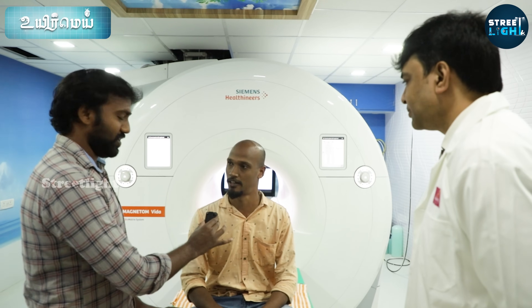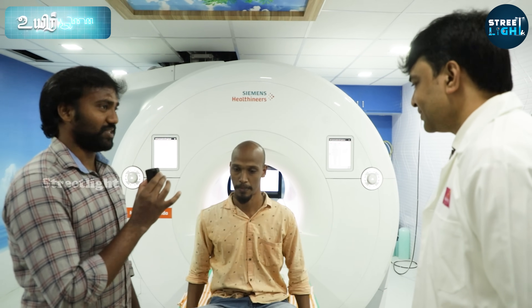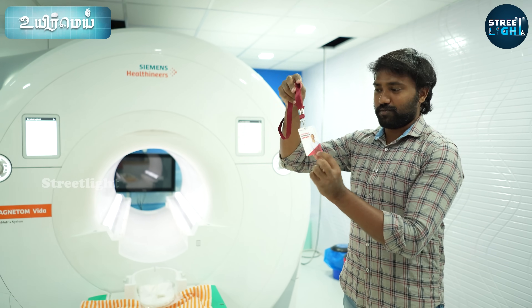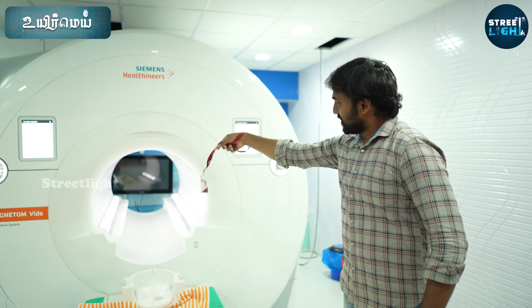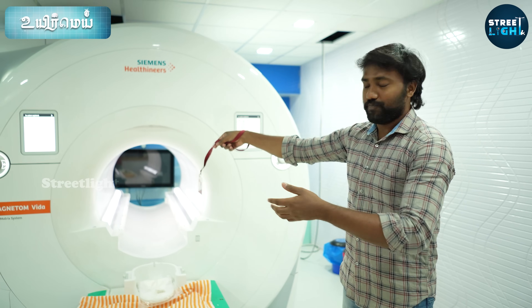The MRI scan is very simple. You can see the results clearly. The ID card and metal objects must be removed before entering. The metal in a card or device is a concern — you need to put all metal in front before entering the scan room.